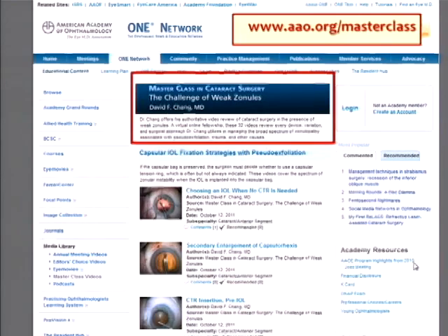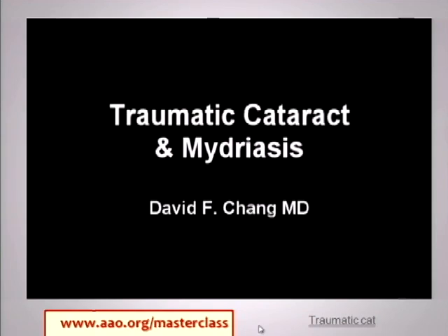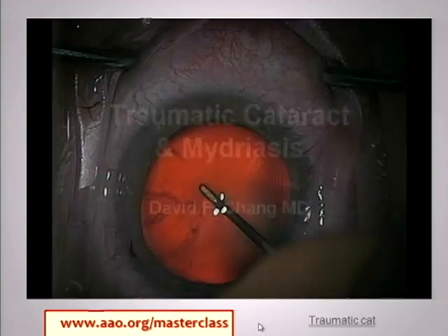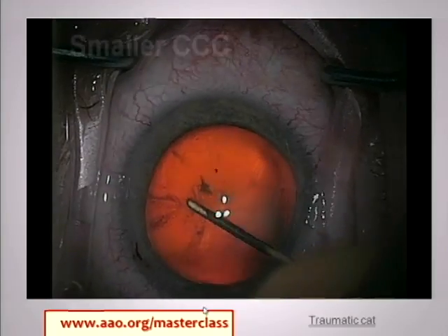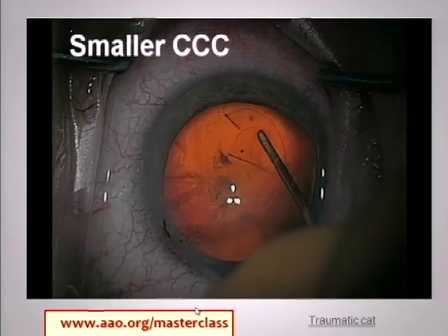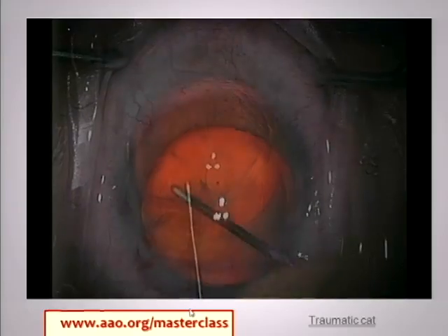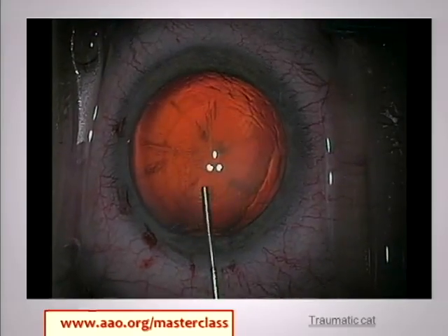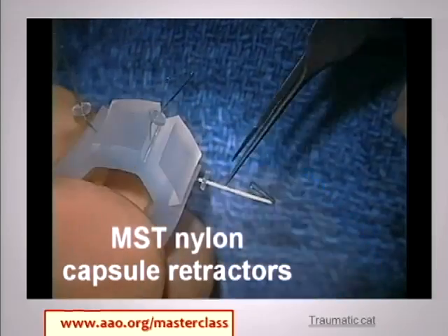Pseudoexfoliation and trauma are the two big sections. This next case is traumatic zonular, traumatic mydriasis, and a cataract. The capsulorexis is your capsule stress test. The first thing we see here is that the bag is very mobile, and I tend to err a little bit on the small side because these are cases where you're more at risk for losing the tear peripherally.